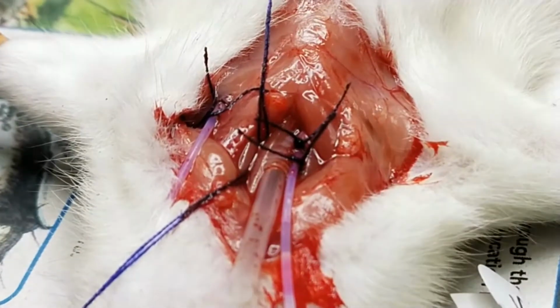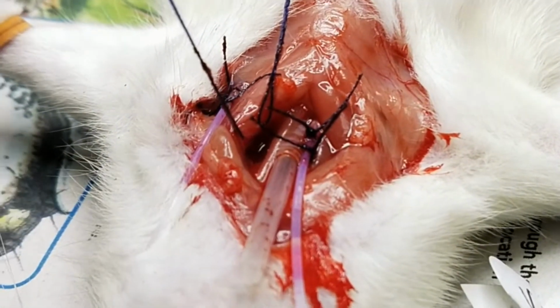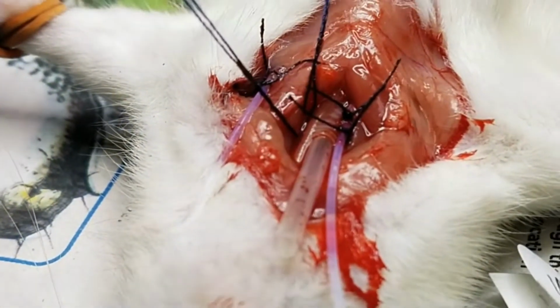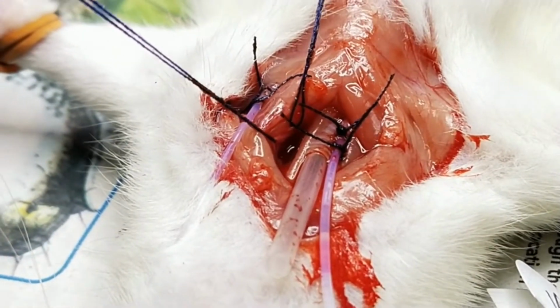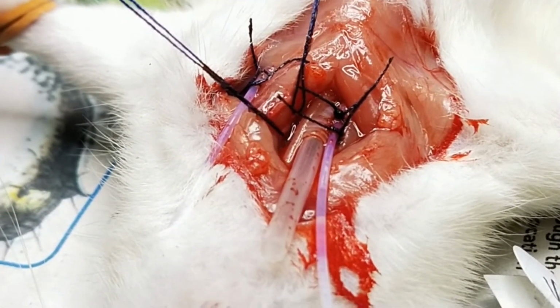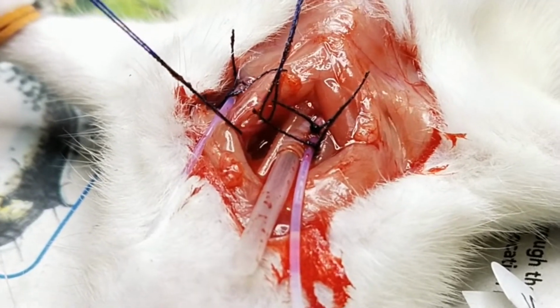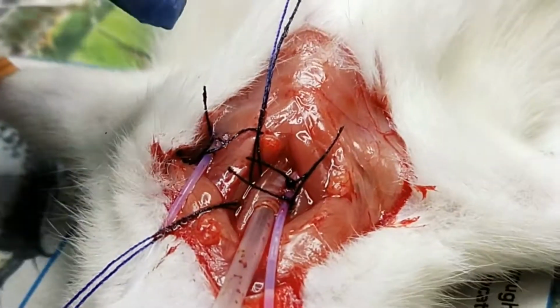The second one is the carotid artery. For the left carotid artery, we are going to use it for the occlusion part. That means we are going to see the effect of the baroreceptor on the blood pressure. And then we also have the jugular vein here.